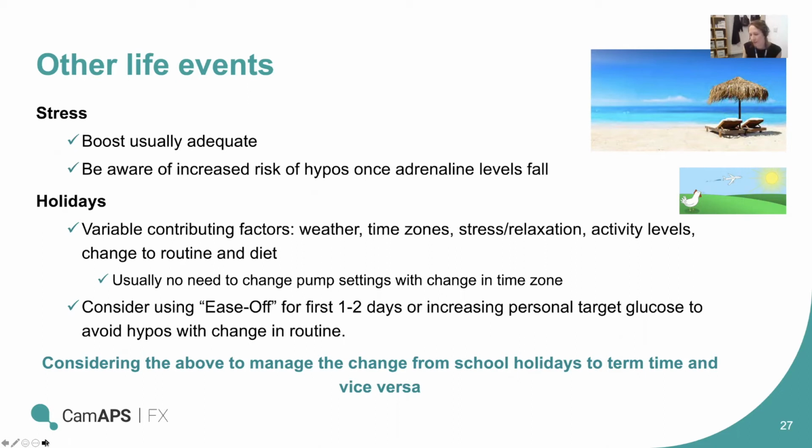More gradual changes in routine, I think, don't necessarily require that, but for these big changes over a short space of time, it might be worth thinking about making the algorithm a bit less aggressive with ease off or increasing the target to help manage those.